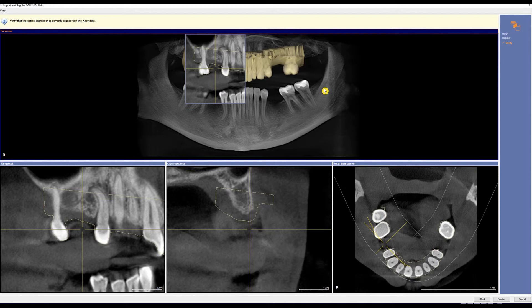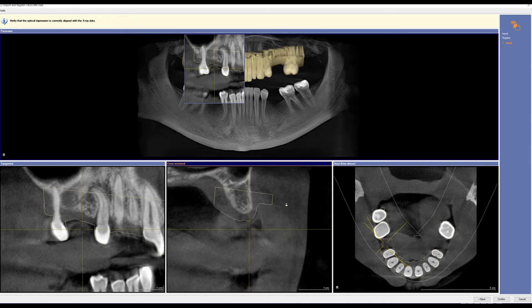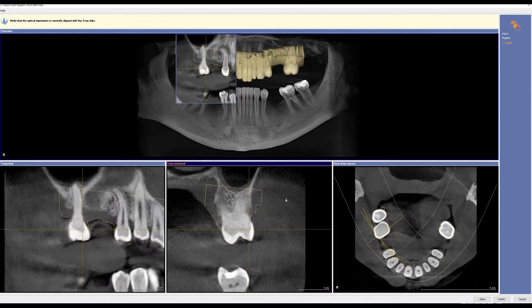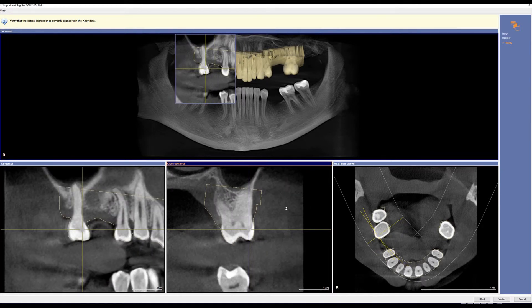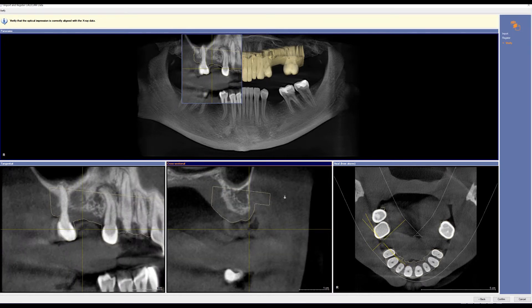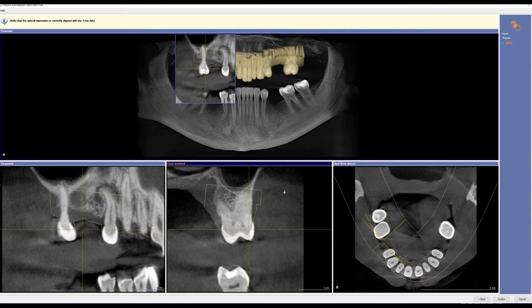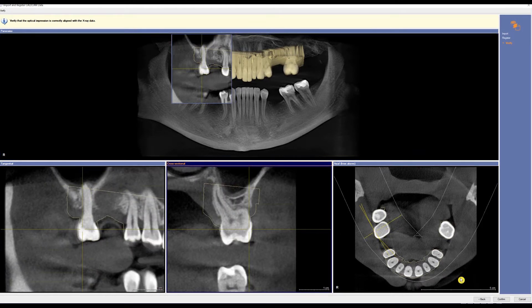Now the SSI file has been registered, and we can verify that by moving our slices through the cross-sectional. As you can see, we have the correct patient's SSI with the correct patient's pan. We'll click Confirm in the lower right-hand corner.